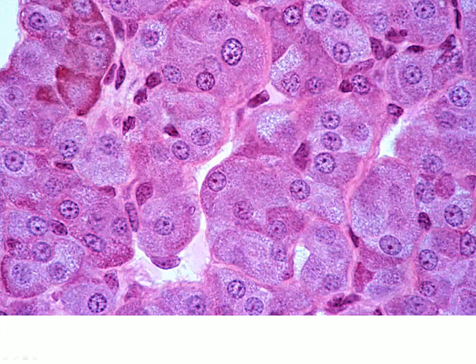And in the medulla, again, this is a situation where you really wouldn't know what we're looking at here unless you had seen a lower magnification slide or saw an inset of a lower magnification slide. But these are just the chromaffin cells present in the medulla that secrete mostly epinephrine. I believe 85% is epinephrine, 15% is norepinephrine.